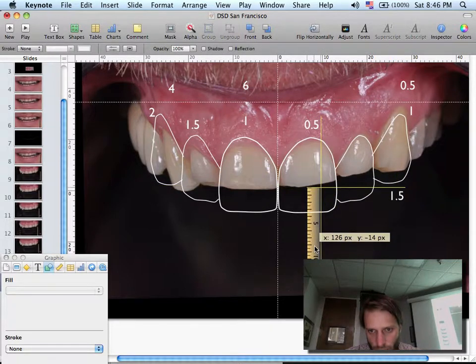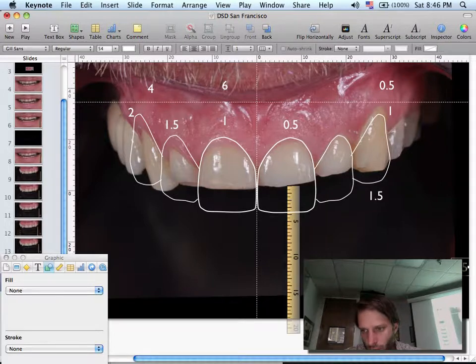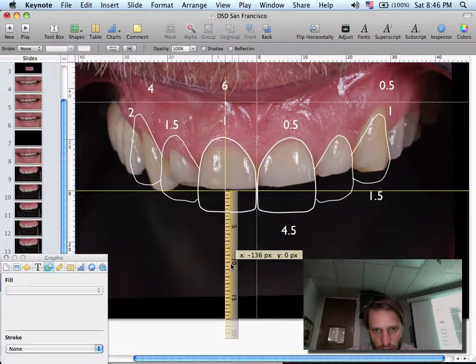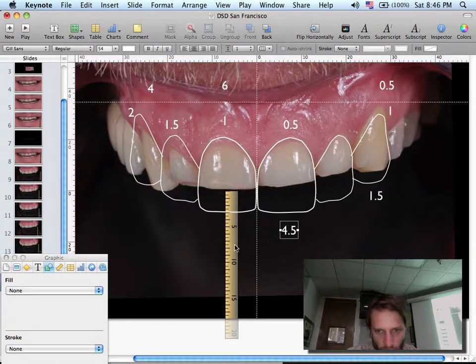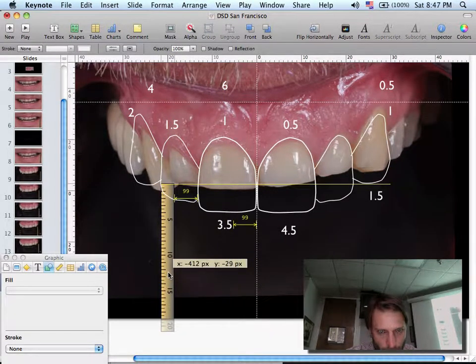I don't care about the laterals. You don't measure your incisal edge from the horizontal line. I measure it from here to the drawing. Approximately 4.5. A little less here. It's 3. No, more. 3.5. 3.5. And this is actually minus 1 here, approximately.